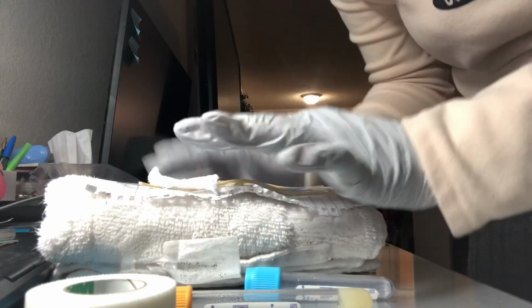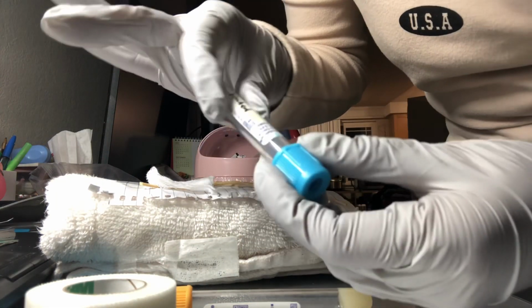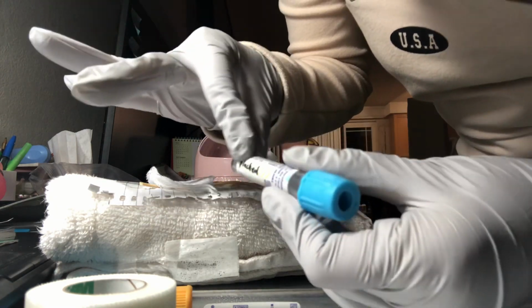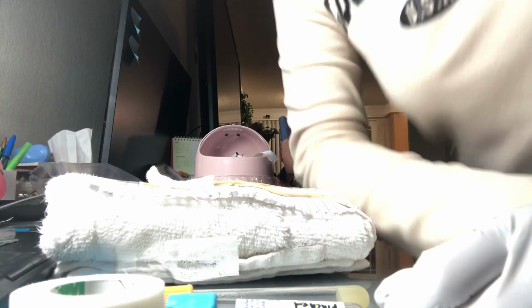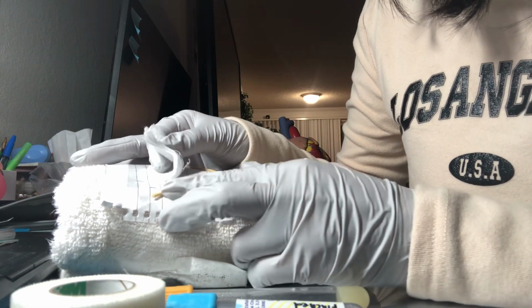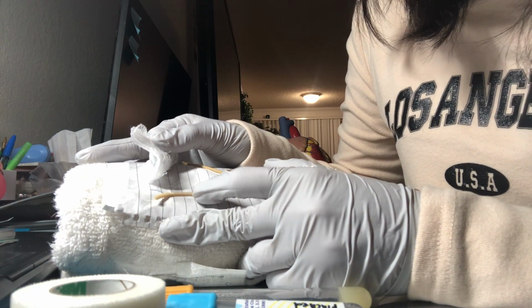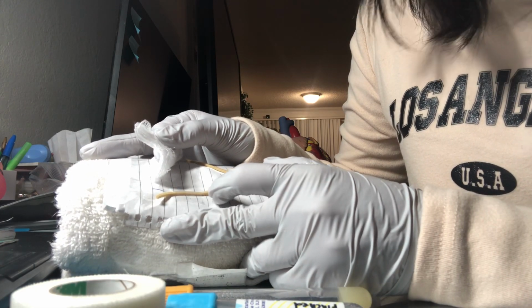I would ask the patient to hold the gauze for 20 to 40 seconds while I fill in the patient label with the patient's first name, last name, date of birth, and my initials. After about 20 to 40 seconds, I would check what is going on under this gauze for any sign of hematoma or irregularities in blood coagulation.